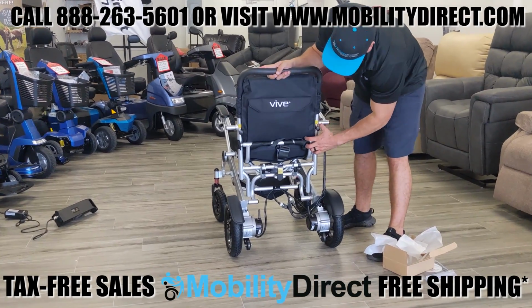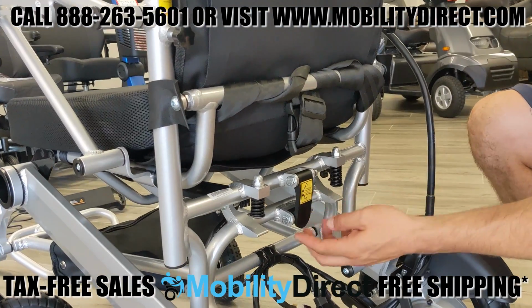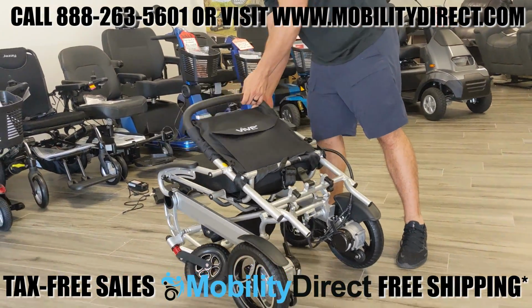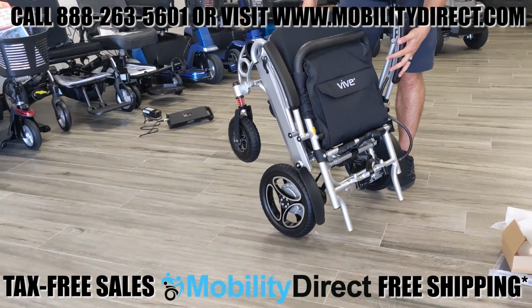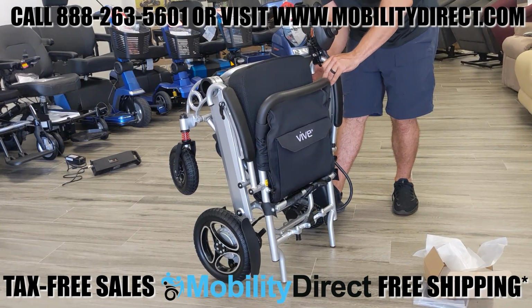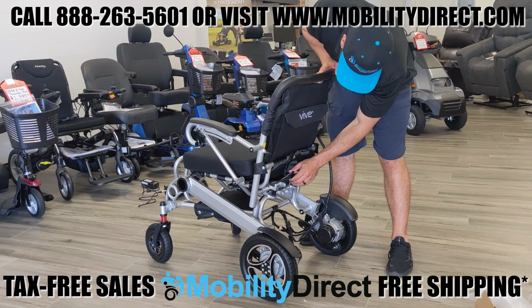Now the latch on the back is simply used to fold and unfold the chair. Make sure you latch the chair into place when you're using it and unlatch it when you're going to fold it. It's very simple to do. Just pull up on that latch and then push the back of the chair down. You will need to adjust the armrest, or else it will stick out if you have the armrest in the highest position. So again, that latch is what it takes to fold and unfold the chair.